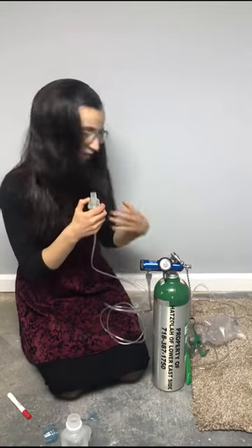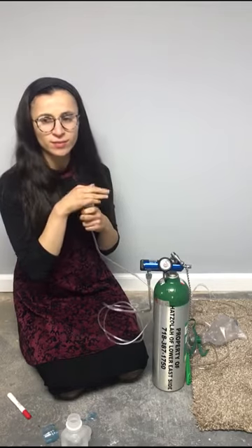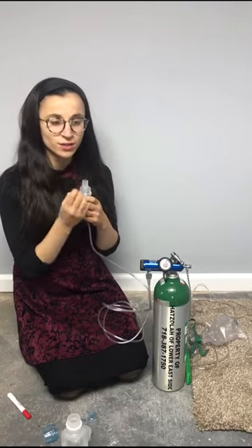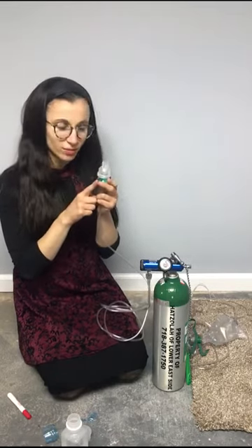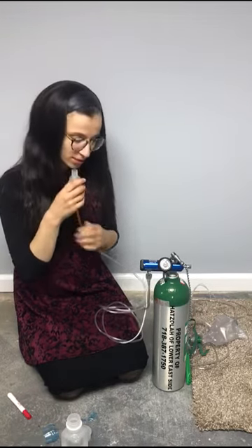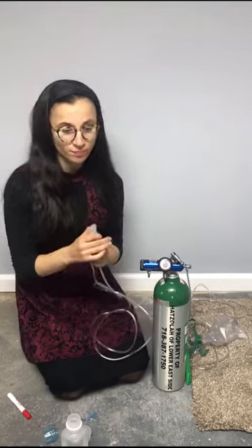This could be connected to tons of different devices. Usually it's used with a simple face mask. It could be used with a lot of different stuff, and you put in either the water or the albuterol or whatever medication you're giving. It's going to mist up and go right by the tube. So that's pretty much the end of it.